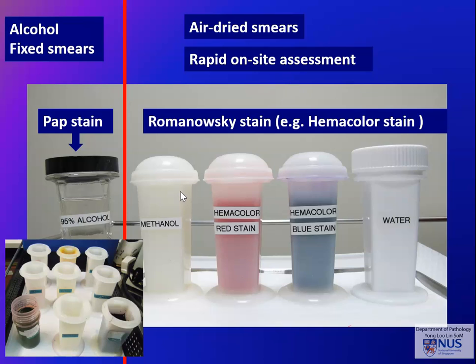So it is very important to note that we are only looking at some of the material that has been aspirated and not all the material. Hence, there is a potential sampling error and there's room for discrepancy in the immediate provisional assessment compared to the final assessment.